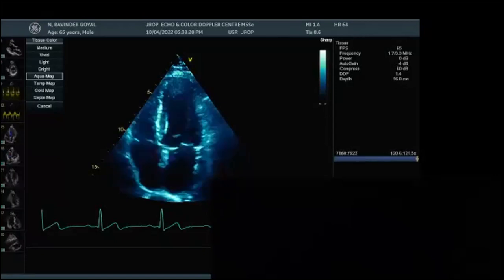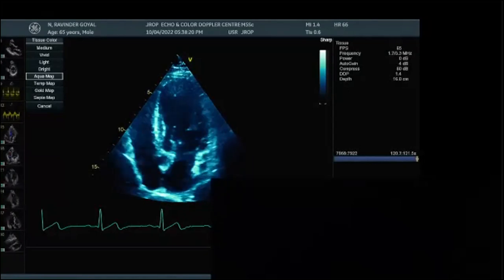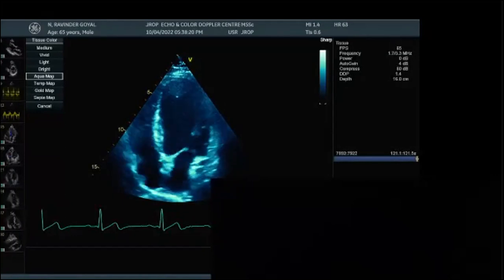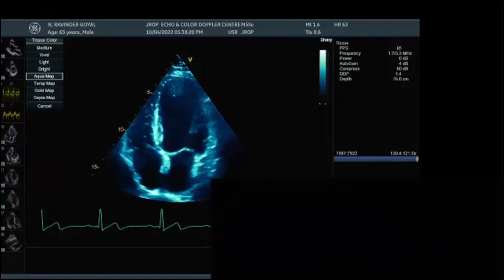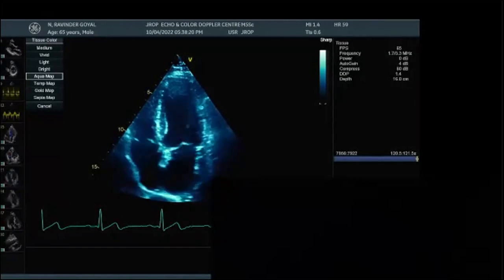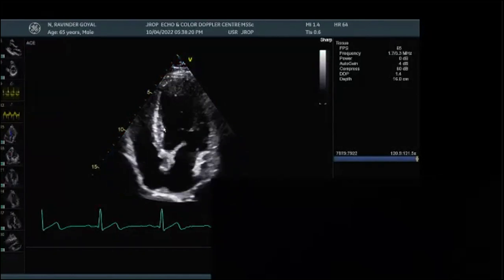Also, sir, as your machine has a button of TVI and other easy measurement buttons, some of the Philips machines or some other machines don't have. They have inbuilt software. So can we have a session on that, or can we have something related to that? No, it's not possible. You have to call your vendor, where your vendor will explain all those things. Okay, sir. Right.